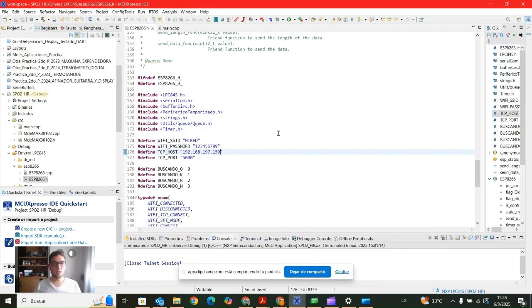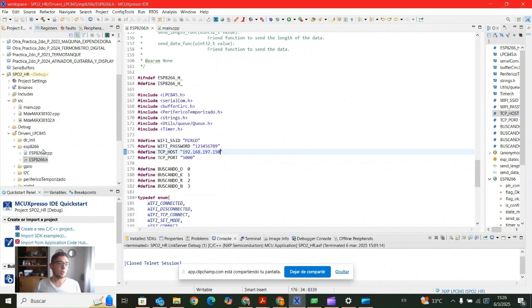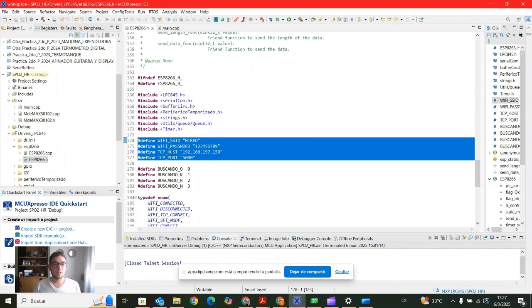At this moment, I'm going to show you how to do some little setups that we need to consider before executing the entire project. Before turning on the project, we should open MCUXpresso IDE, then open the project previously configured, choose the ESP8266 folder, choose the .h file, the ESP8266.h file. Then we are going to look at some lines, specifically these define lines.